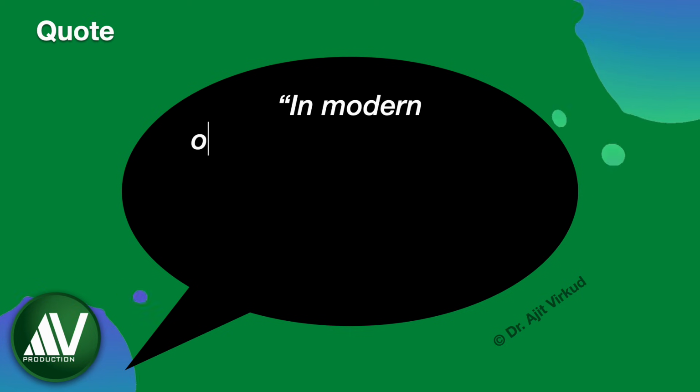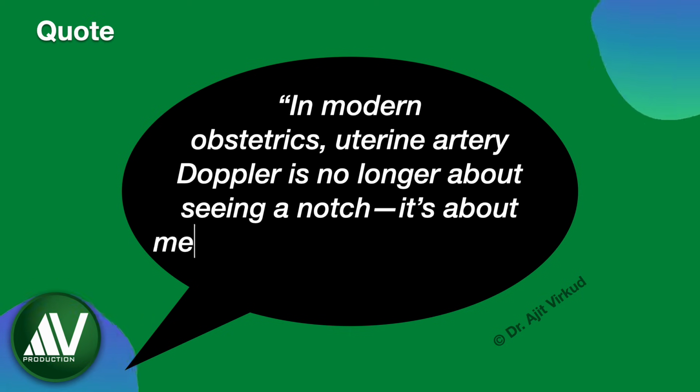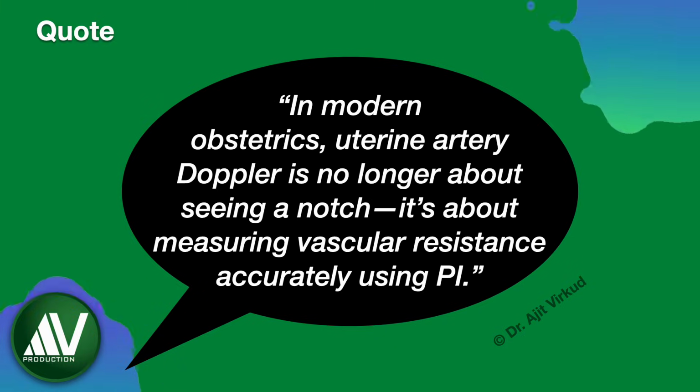I will end with this quote. In modern obstetrics, uterine artery Doppler is no longer about seeing a notch. It is about measuring vascular resistance accurately using mean Pulsatility Index (PI).